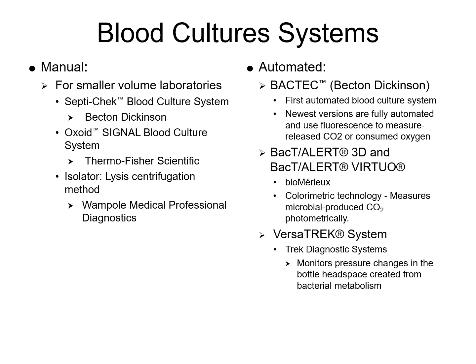Now, a large portion of the specimens that you get in micro will be blood culture samples as well. Blood culture samples, as you recall, are typically drawn with 2 sets for 24 hours, and then a lot of times physicians will repeat those every day or two. Just depends on the physician, really, how they're monitoring the patient, or what's going on with the patient.